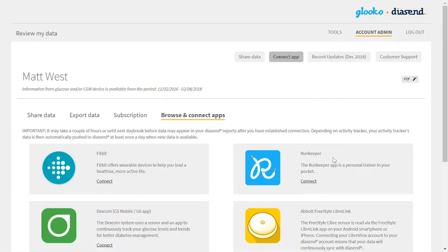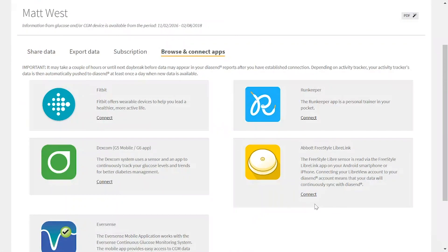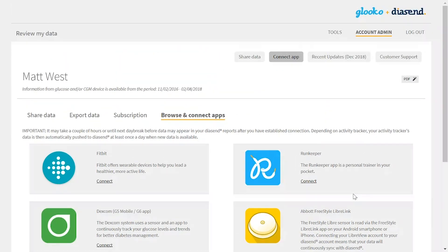Once connected, they will see confirmation on their Diacend profile saying that the third-party app is connected with their Diacend account. This will create a continuous data stream, ensuring that the data from the third-party application is pulled into their Diacend account. And if they are sharing with the clinician, the clinician will also be kept up to date with their diabetes data.